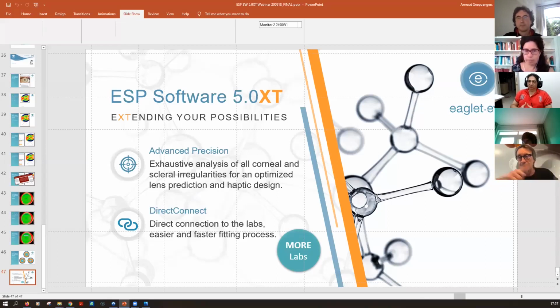And that's another useful tip to put in, which we didn't put into the system. Once those drops are in and then blinked around for 30 seconds or so, then that eye's done. And I'll do the right eye, take the images, and then we'll do the same in the left eye, but we reinstill from scratch on that eye. I think that's another advanced tip I would put into place.